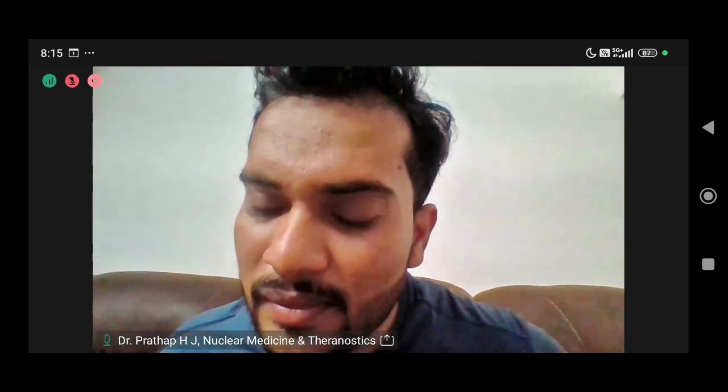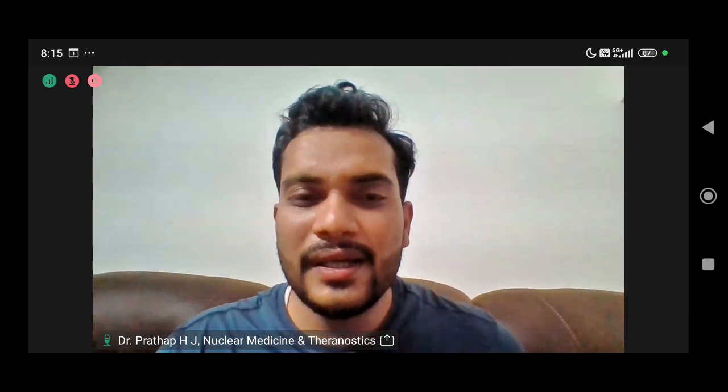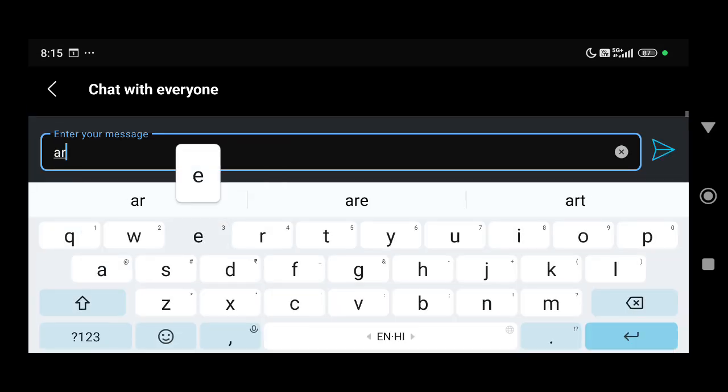Limitations of FAPI PET and therapy. Yeah, one limitation of FAPI PET is, first of all, the technicality. It cannot be done in each center because technical expertise is required, and maintaining the cost at the same level, that is one limitation.